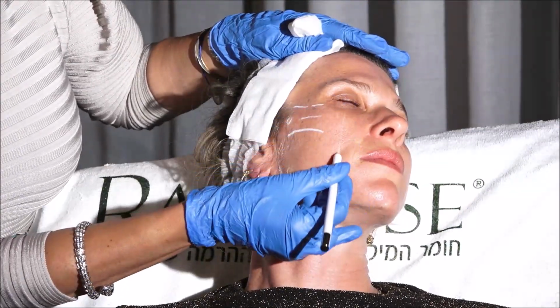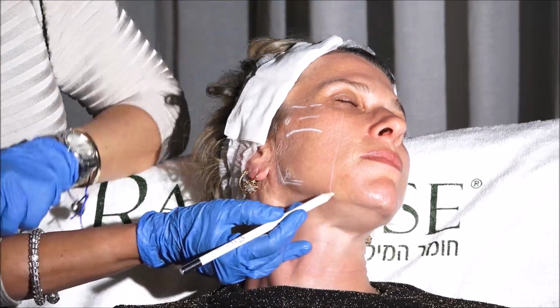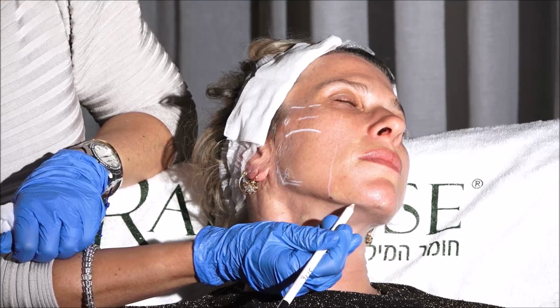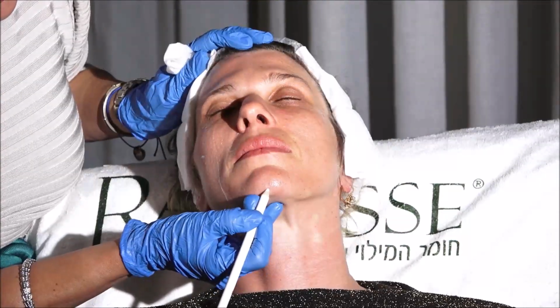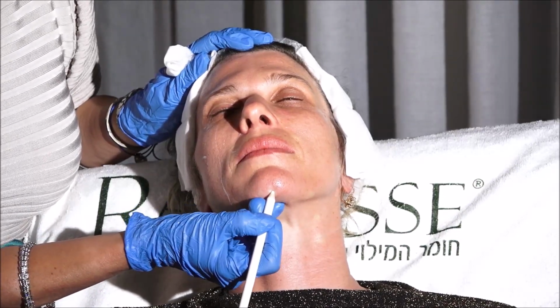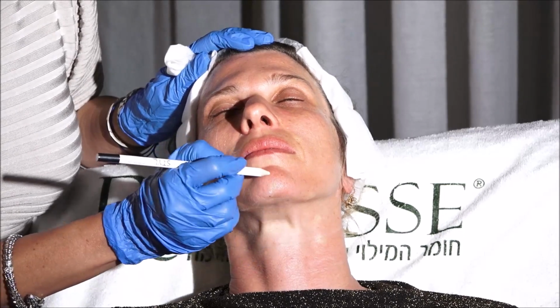Pupillary line down, lower border. This is where I'm going to enter to treat the angle and this connection to the chin. Midline, lower border. This is where I enter to project the lower part of the chin, not the pogonion. Pogonion is fine.